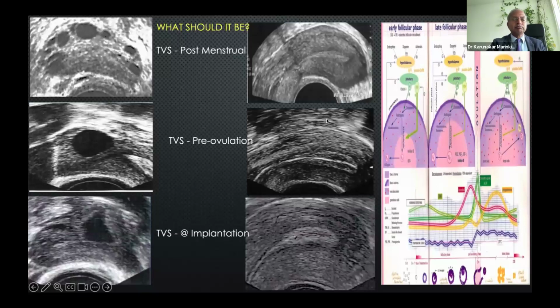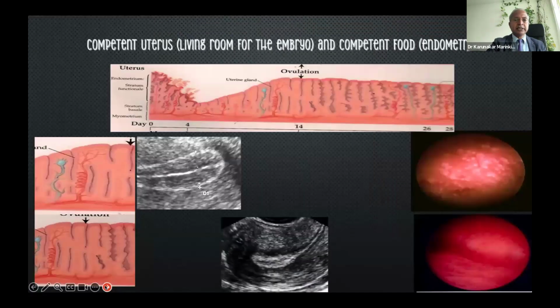I've done this over thousands and thousands of patients. So ultrasound has a high correlation to the endocrinology. Therefore, I encourage mid-cycle scan to be your opening. I don't routinely do FSH, LH, AMH because I can count antral follicles. I don't always need AMH or LH. There's no clear indication for that.